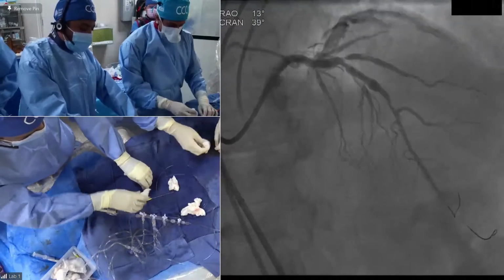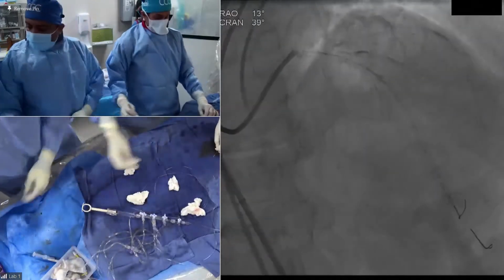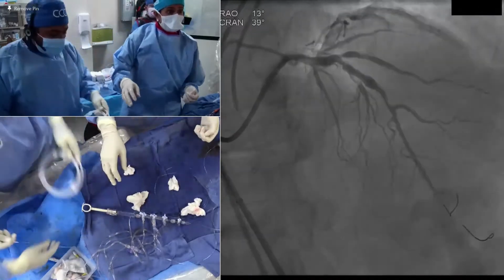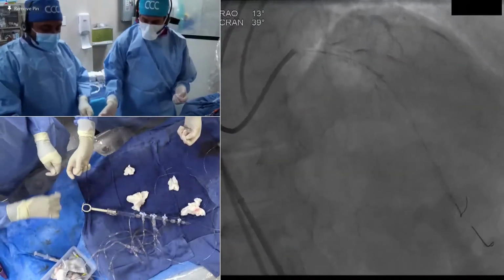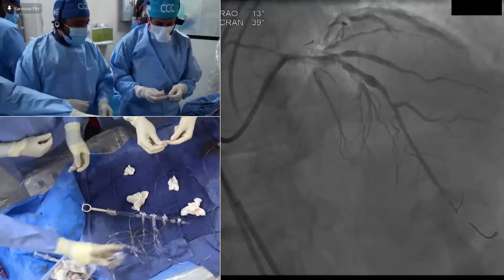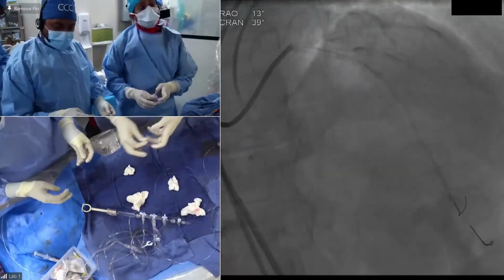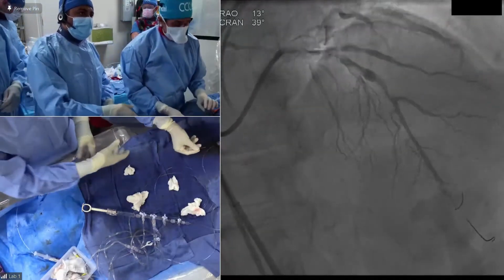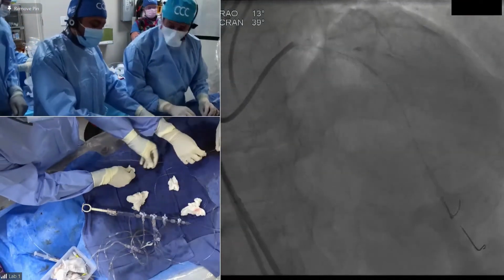That said, it's not always impossible, and we've succeeded a few times, typically in full metal jacket LADs with relentless angina. This could be a good indication for drug-coated balloon. We talked before at lunch with Antonio about it. So what do you want to use, 3.5? This could be a great 3.5, high pressure. We don't have it approved in 3.5 in the US, but there is one. Yeah, good. That's what we said.